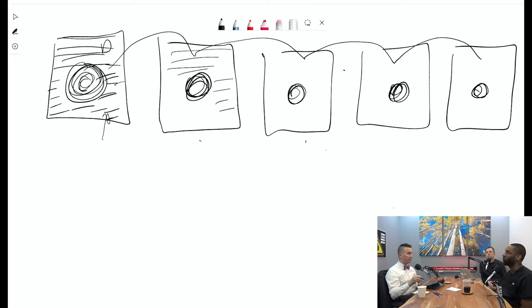How do you know if they screwed the pooch? If every single phase is blurry, no matter what, because the contrast looks good but everything's blurry, that would be a good indication. I see, because it doesn't usually reconstruct until the end, so you won't even know to stop it. Well, what can you do anyway? The contrast is going, right? So that's a technique, and we continue to go on.